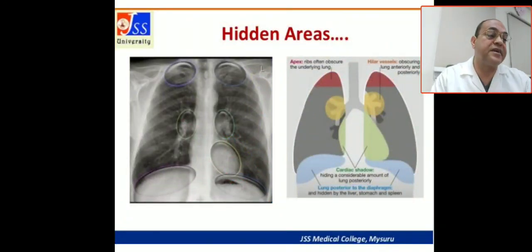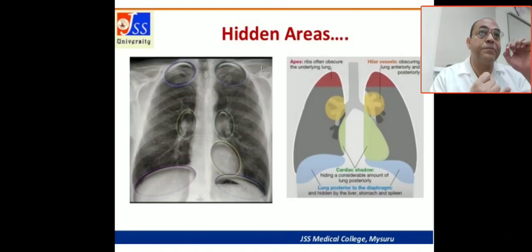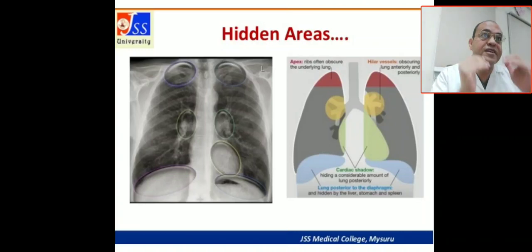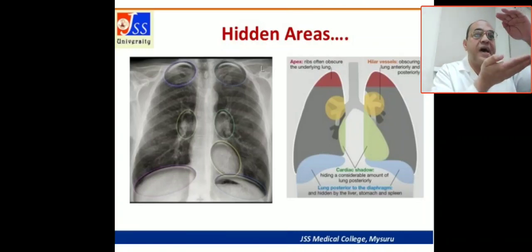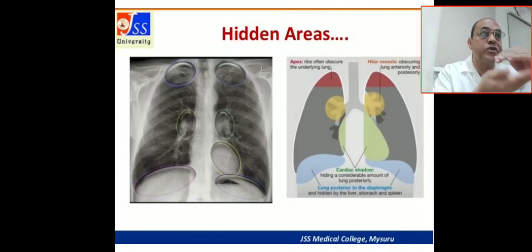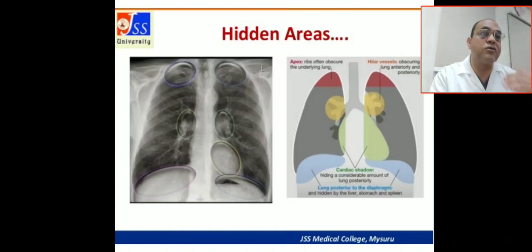As we mentioned, the apical part can be obscured by the clavicle, which hides underlying pathology. You have to look carefully at both the right and left apical parts. Regarding the hilar area, the hilar vessels can obscure the lung anteriorly and posteriorly, so you have to dig for the underlying pathology.